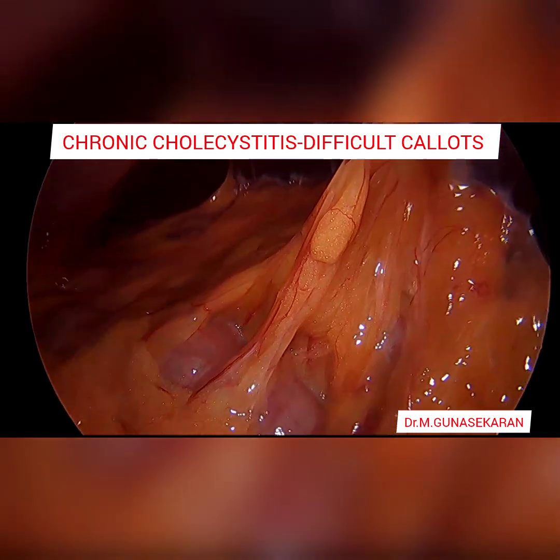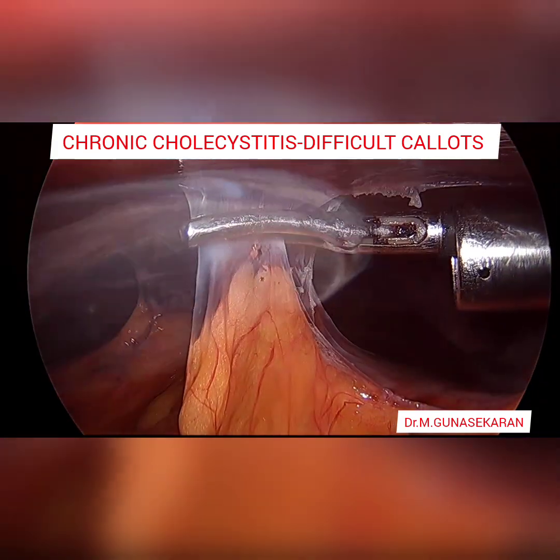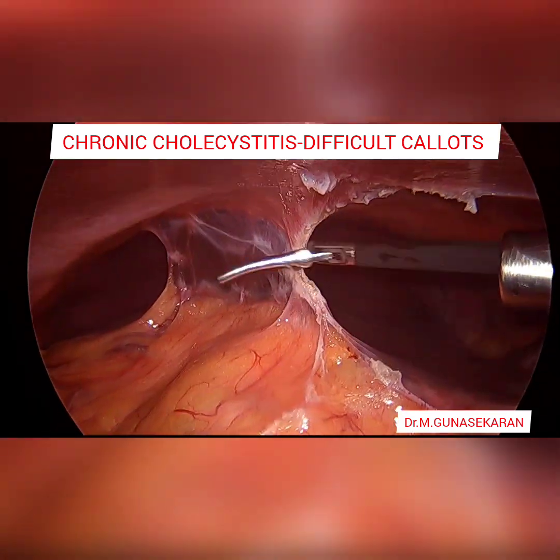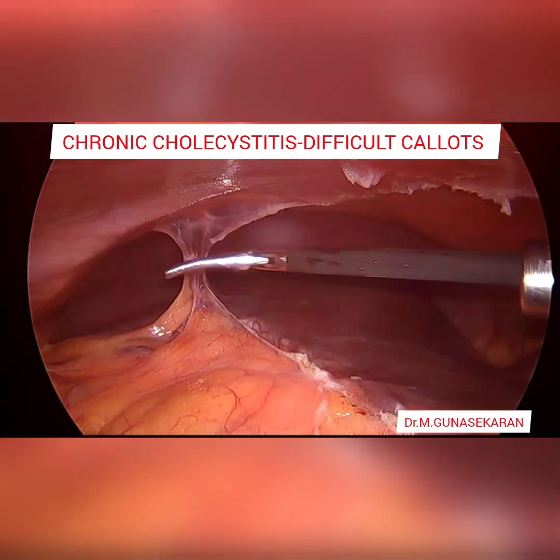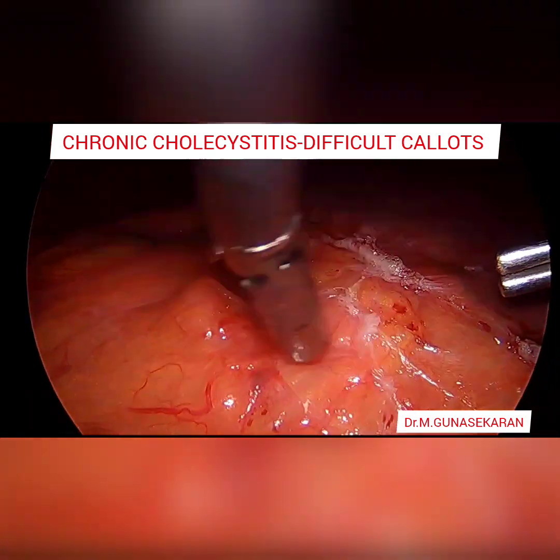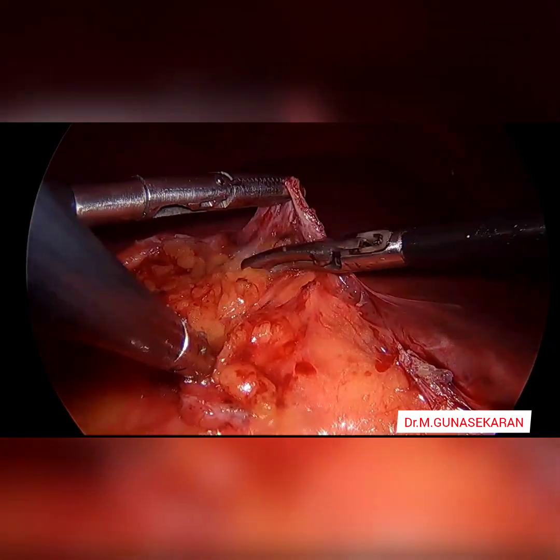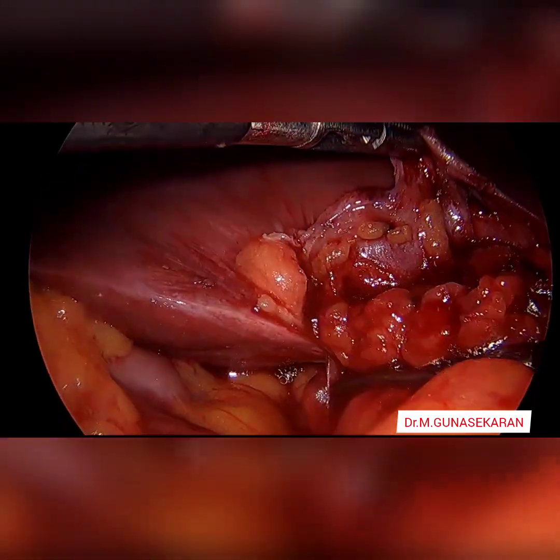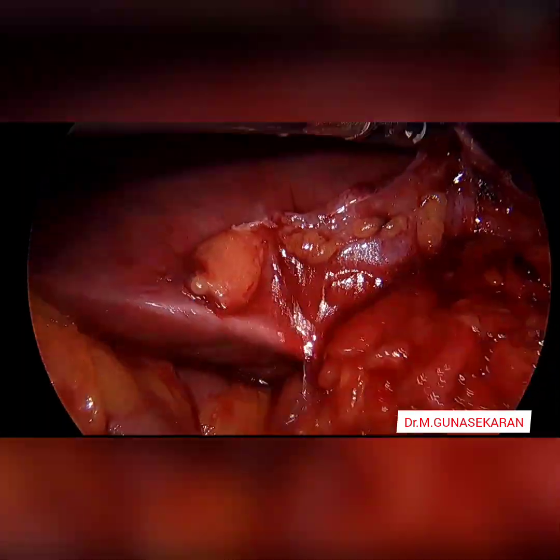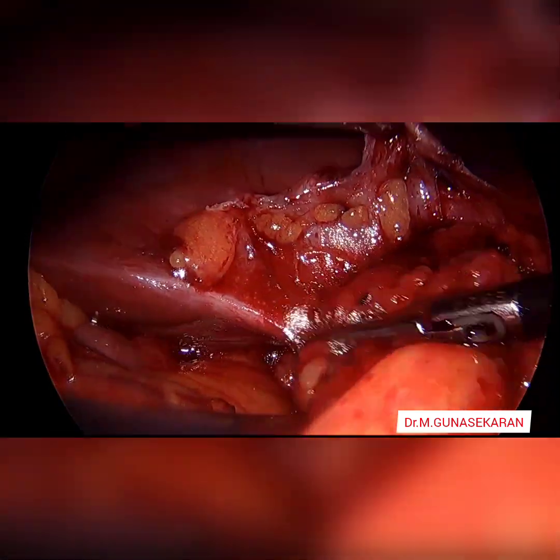This is a case of chronic calculus cholecystitis. This patient had multiple attacks before, and ongoing pain brought him to surgery. The inferior part of the liver is completely covered with omentum. There are dense adhesions between the omentum, liver, and gallbladder. I am unable to see any part of the gallbladder, and I am now dissecting, separating the omentum from the inferior part of the liver.